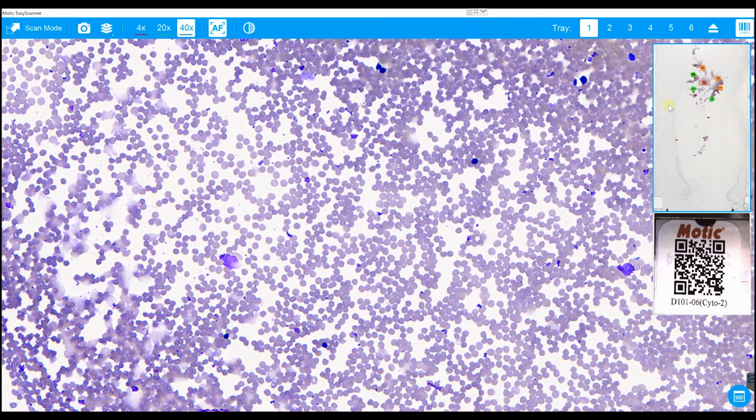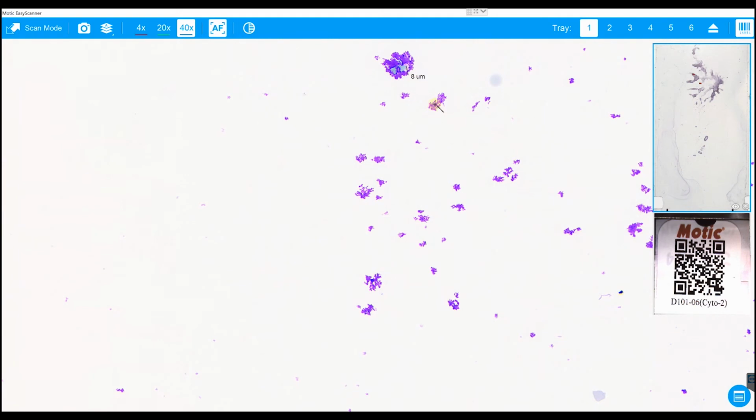If the user would like to clear markers in previous heat mapping of areas, simply press Ctrl and the letter R. Pressing the Control key, clicking the right mouse button, and moving the mouse in any desired direction will trigger the measure tool.